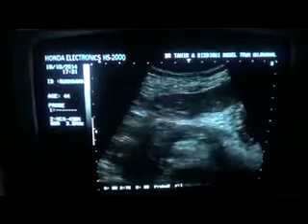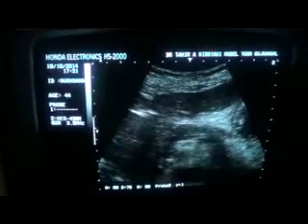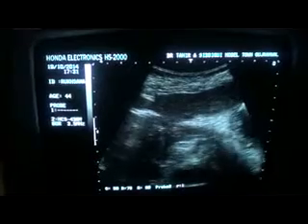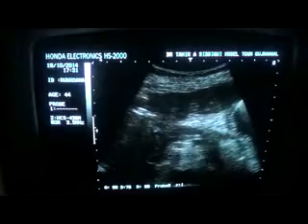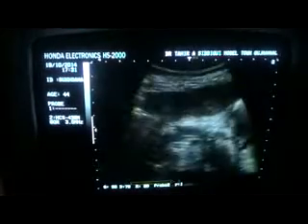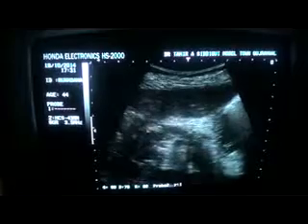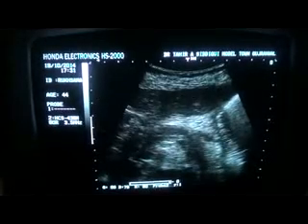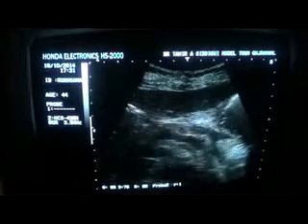Now what you are seeing in front of your screen is in fact the body of the pancreas in transverse section, in the center of which you are seeing the duct. I will label it for you, just a minute. Let us get a good view.